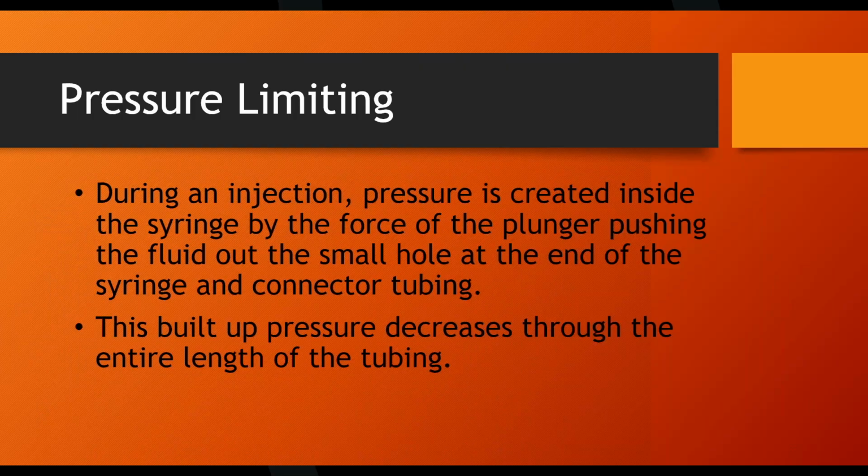When it comes to shooting a shot, the operator has to enter the protocol that they want to shoot the patient with. Having said that, they rarely actually enter the protocol. In this X-ray room, they'll have a handful of procedures they actually do in this room. They don't do every single thing under the sun in this particular room.